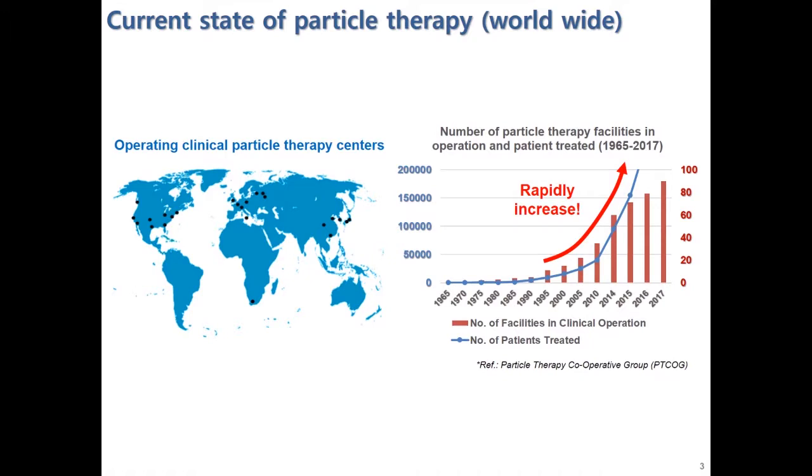Because of these advantages, the interest in the particle therapy has rapidly increased. After the introduction of medical dedicated accelerators in the 1990s, the number of particle therapy centers and patients treated by particle therapy has dramatically increased.